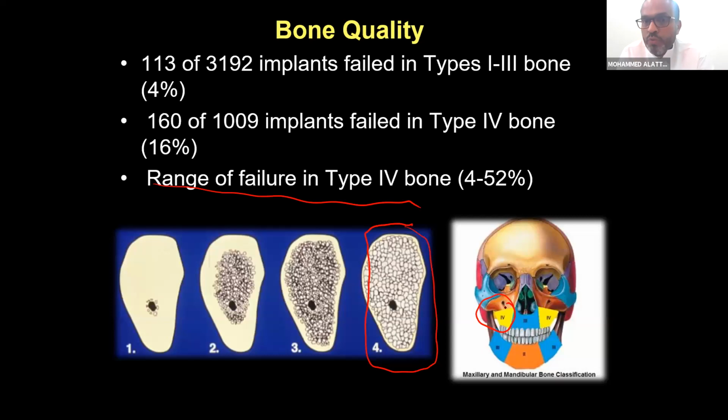As a clinician, I should think how I can reduce the force on my implants and on my crowns in this area. Regarding the number of teeth that I will make, sometimes you will do over-engineering and replace each missing tooth, and sometimes you will connect your final prosthesis to accommodate what the patient's bone quality and quantity has in that area.